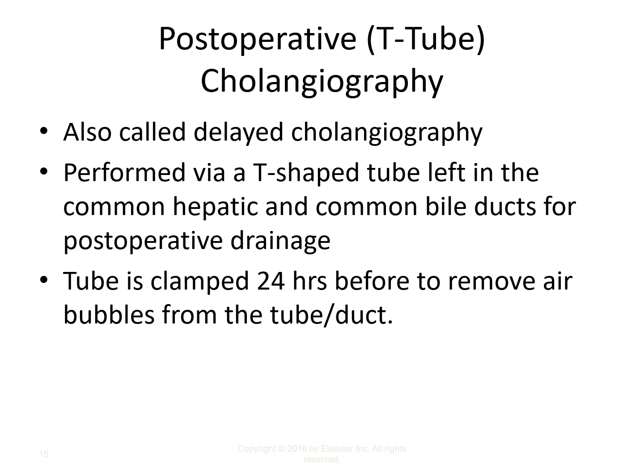The pressure between the biliary system and the small bowel might reverse, and you might actually draw air in via the sphincter of Oddi. Now, air will create a filling defect, and it will be indistinguishable from a gallstone during the procedure. So to prevent an air-filled duct, you want to clamp off the T-tube for fluoroscopy the next day, evaluation fluoroscopy and injection the next day.